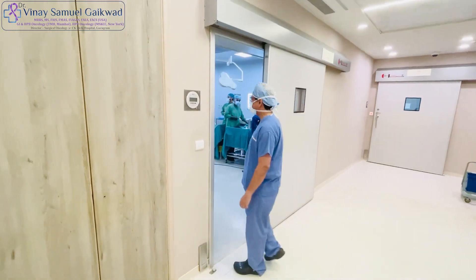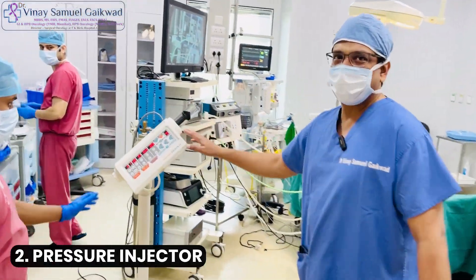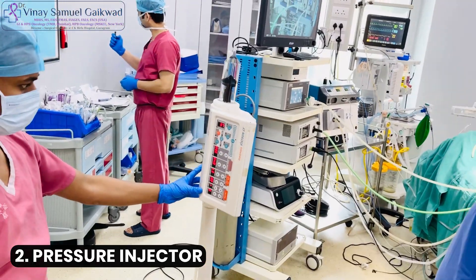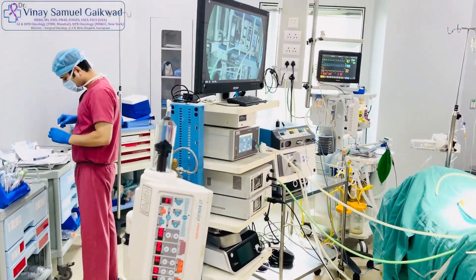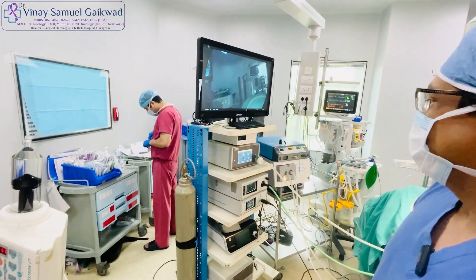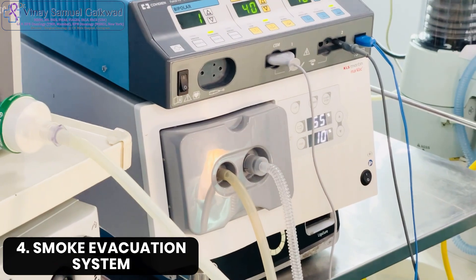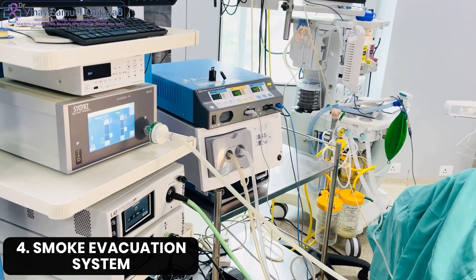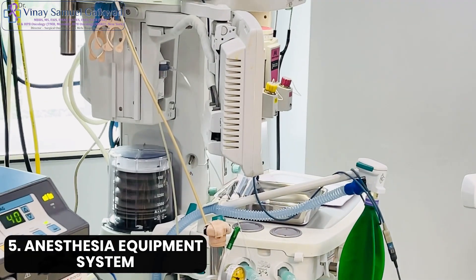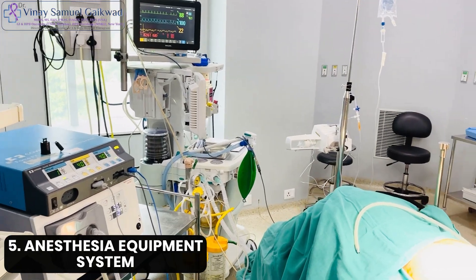Now we'll go inside the operation theatre. You can see that the first thing you need is a pressure injector, which you can get from the radiology department, the cath lab department, or the cardiology department. You need a full laparoscopic stack with good vision. Then you need a smoke evacuation system which gets all the chemotherapy out of the abdomen. You also need good anaesthesia equipment facing the door, because we'll be going outside the theatre when the PIPAC is going on.